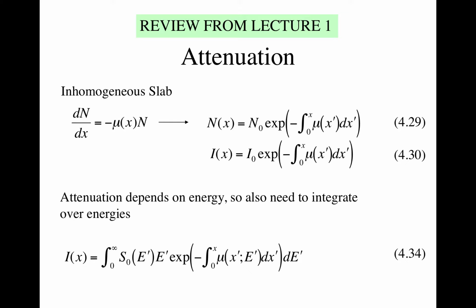Perhaps, to think about it in simple terms, if we could divide our energy spectrum into 10 bands, very low energy, a little bit more, so that function is just 10 bands. I would just calculate 10 different images, right? And the mu value would be the mean of each band, and then add all of those up to get my final image. And that's this integration over energy. That's a real pain in the neck, to say the least.